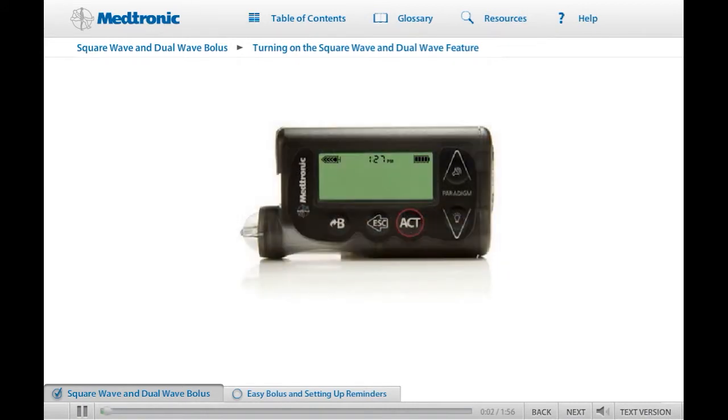This part of the training will go over some optional features that can be used on your pump. Most people prefer to use these options after they are familiar with the basics, but some people want to start using one or more of these features right away. Talk to your health care provider about the right time for you to start using these features.